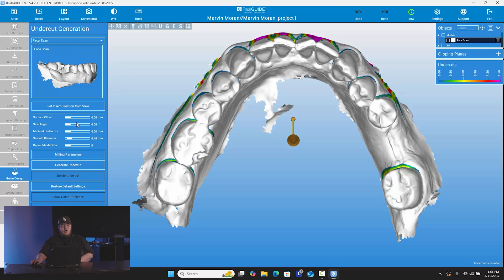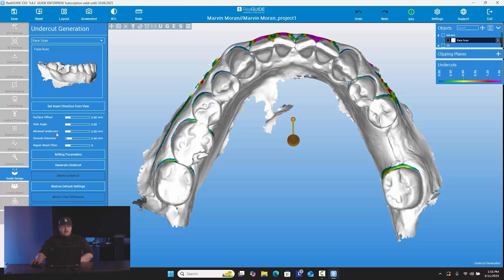So for us, we do have that one chosen. All these offsets and different parameters that are here, I keep them all the same. The software has really good defaults — we don't really need a surface offset, we don't need any side angles, the minimal undercuts we don't really need much of. The smooth diameter is the only one with any number altered, which is 0.40. That's totally fine to keep. Repair mesh filter is at zero, so you don't need to change any of that. I never do — I keep it exactly how it is.